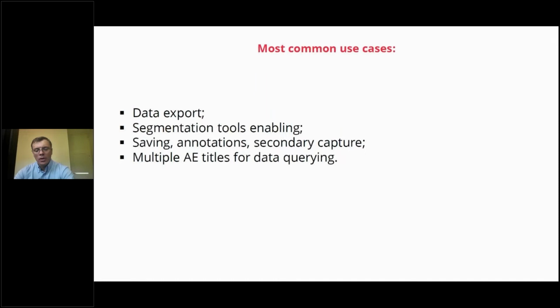So what we invented, and in version 7.9 is already available, is the possibility to configure MedDream to communicate with the PACS system not through one AE title, but through several ones. Then you could parallelize the requests to the PACS, as some PACS limit speed for one connection. So when you have 4 connections, you can triple or even make faster the download of the data, and then you could achieve a better result.